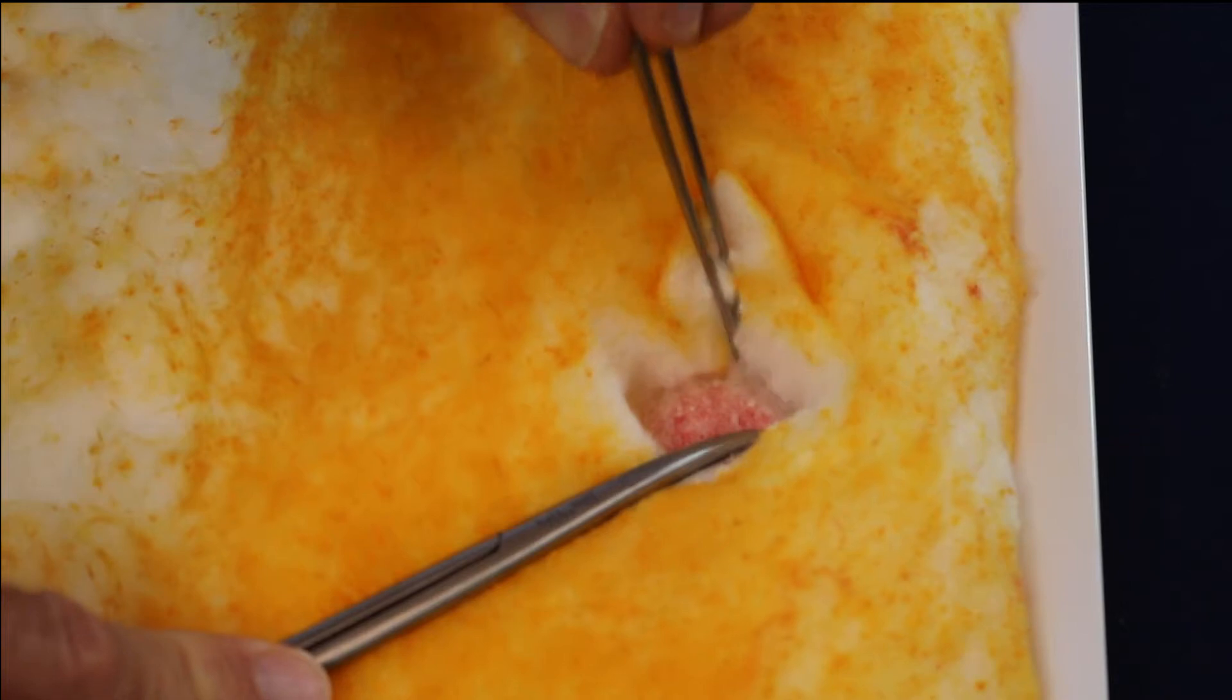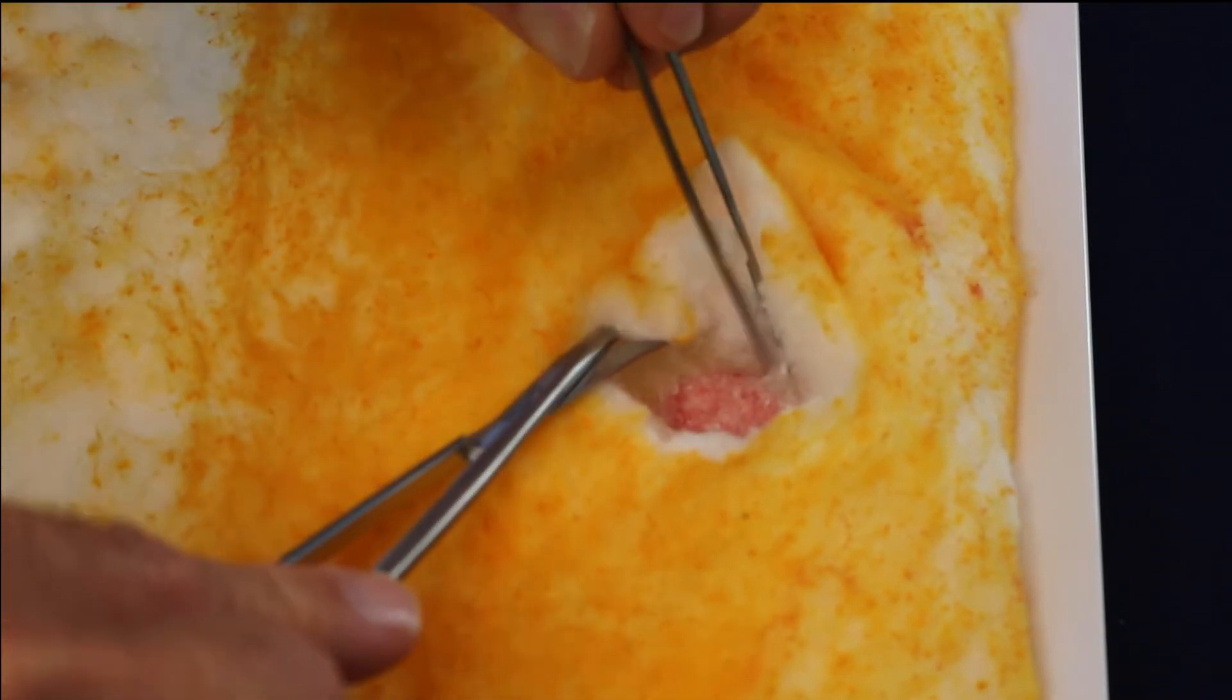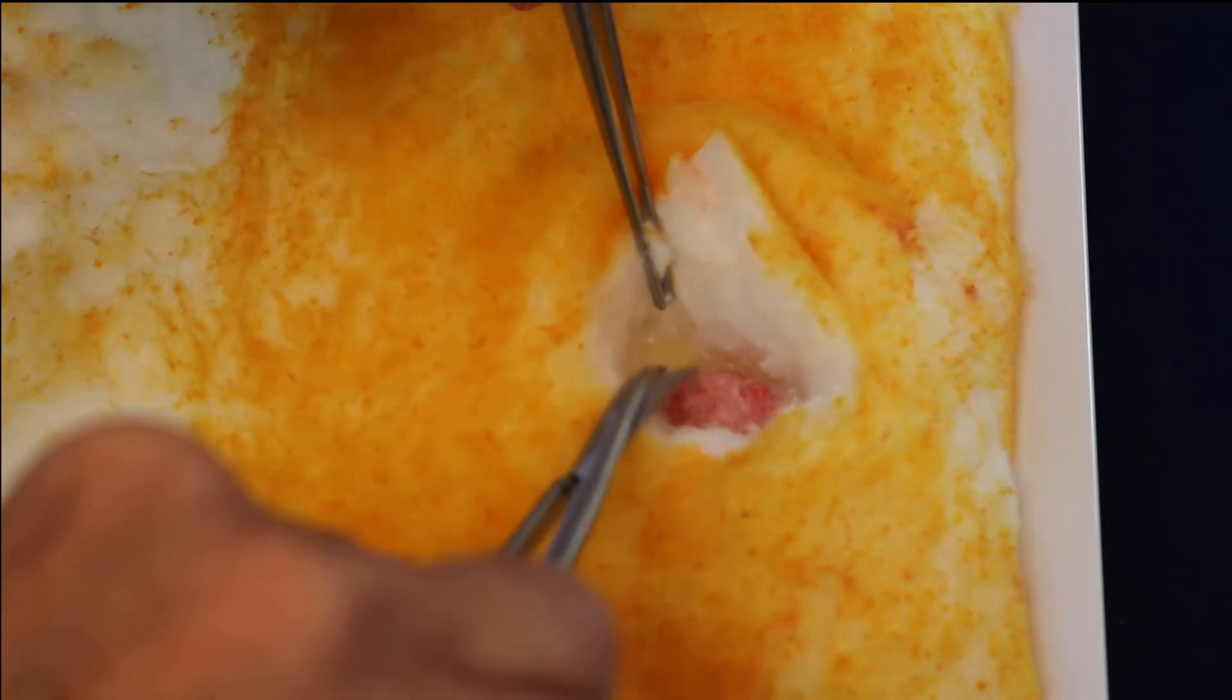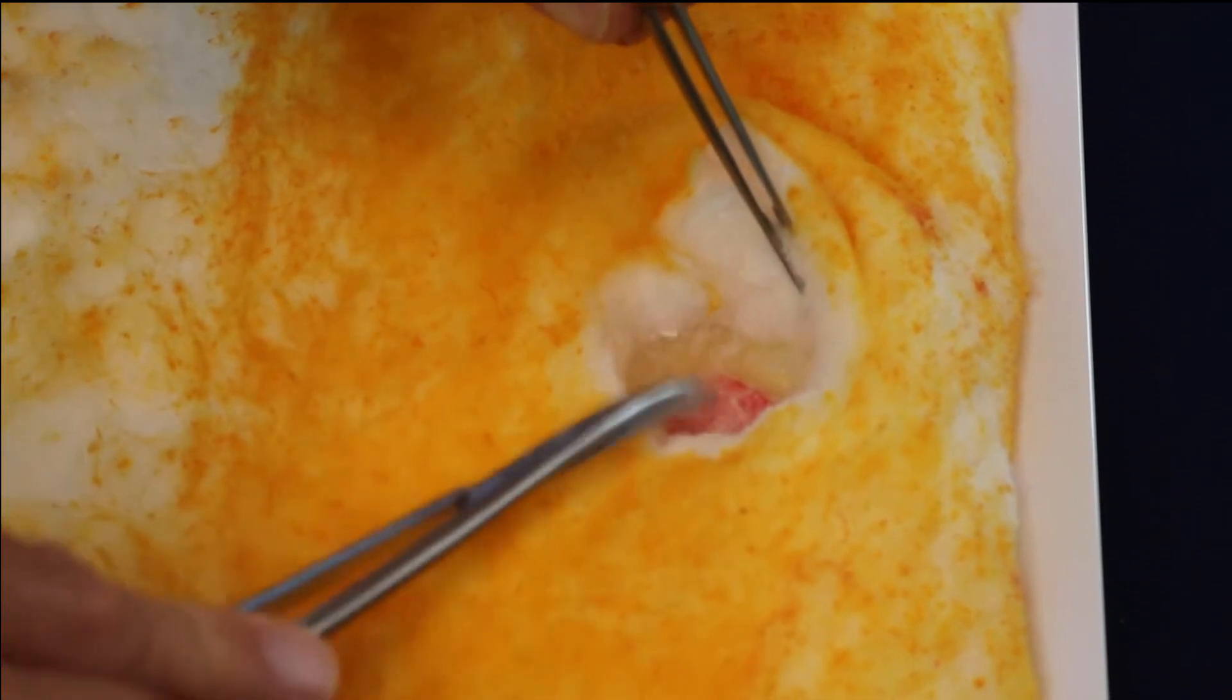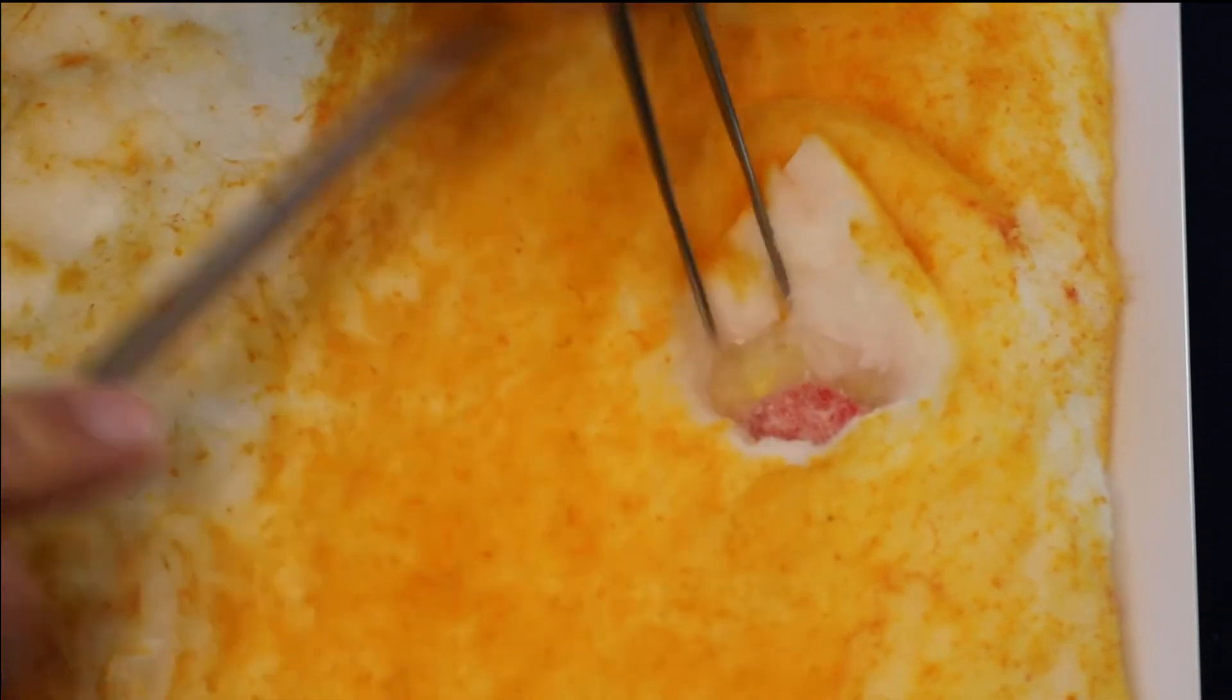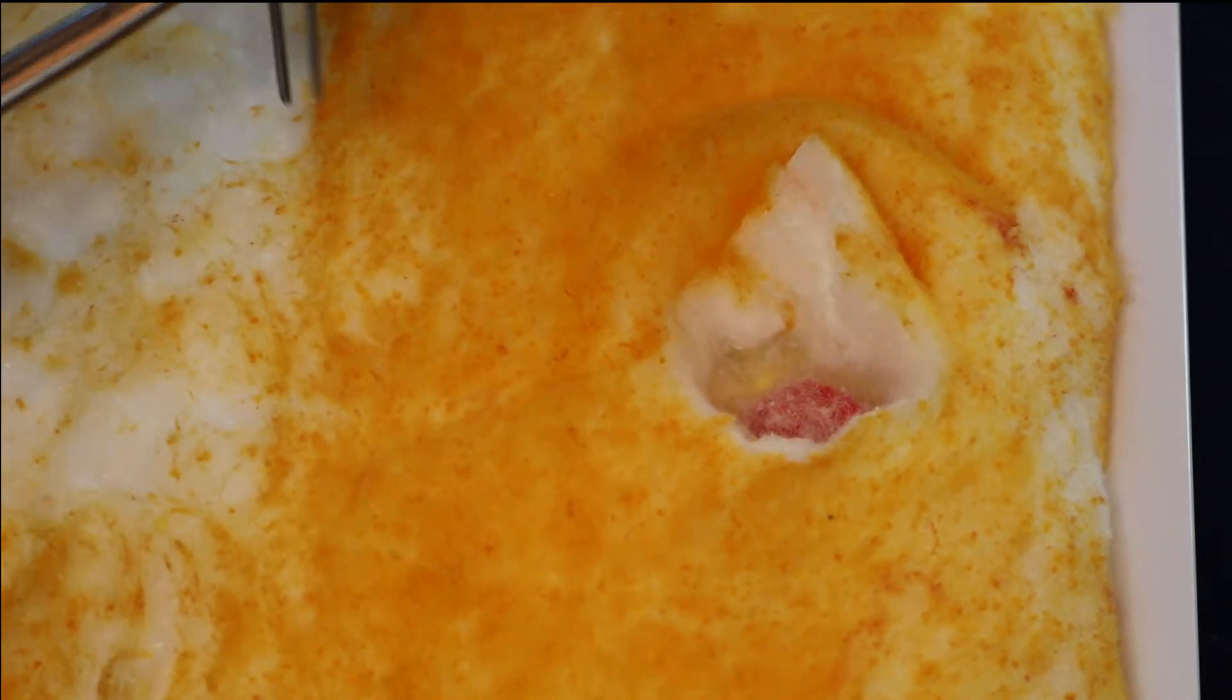Once you have clearly identified the superior surface, begin the dissection out laterally. You should grasp the simulated subcutaneous tissue with your forceps and create a small plane around the mass. This may require cutting or tissue separation depending on how adherent the surrounding material is. Try and develop the plane that leaves little of the simulated subcutaneous tissue on the mass.